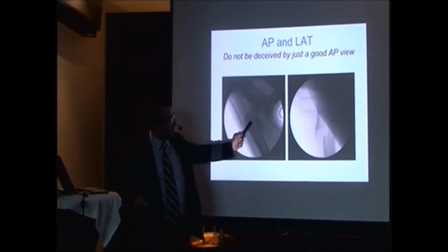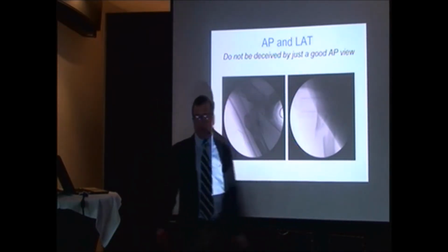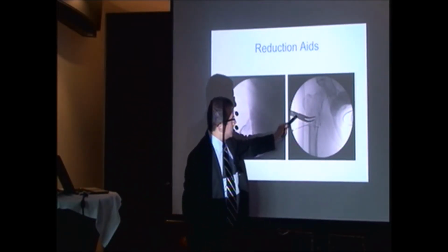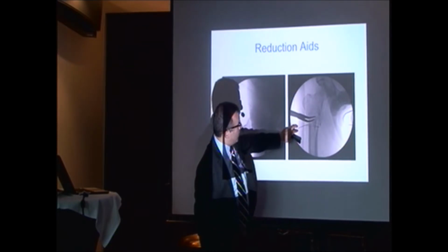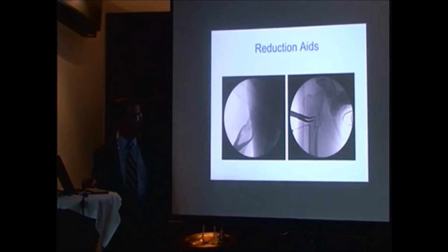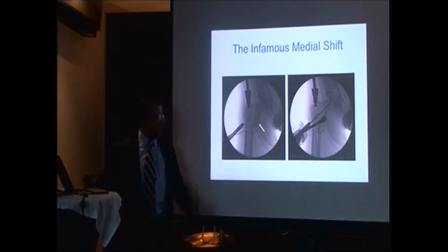And this is very deceiving because you would look and say, oh, it looks very good. Let's go ahead and start. But what you don't see is this. And this is very common in the young people. And so you have to be willing to have a very low threshold to just open it. When you put your screw in, if you look at the skin, your incision is going to be right here. So instead of making a small 1 centimeter incision, just make a 4 centimeter incision. You can put the clamp in, you can put a wire. I don't like cables, but we use cerclage wires that basically approximate the bone and allow the nailing to succeed without having everything blow apart.